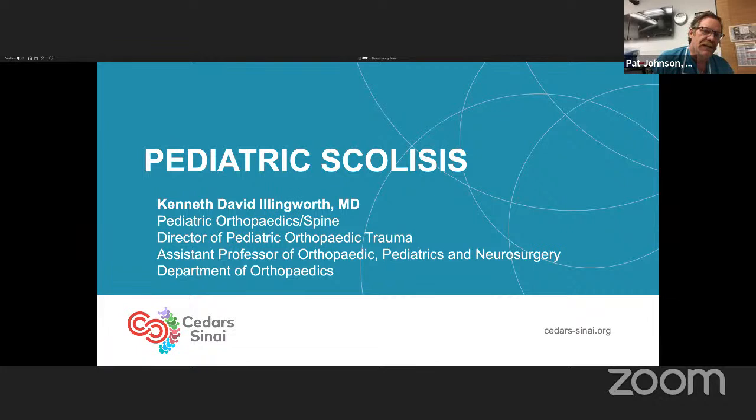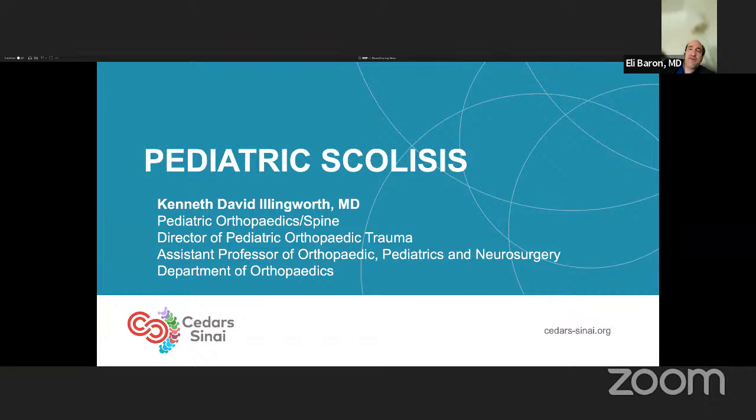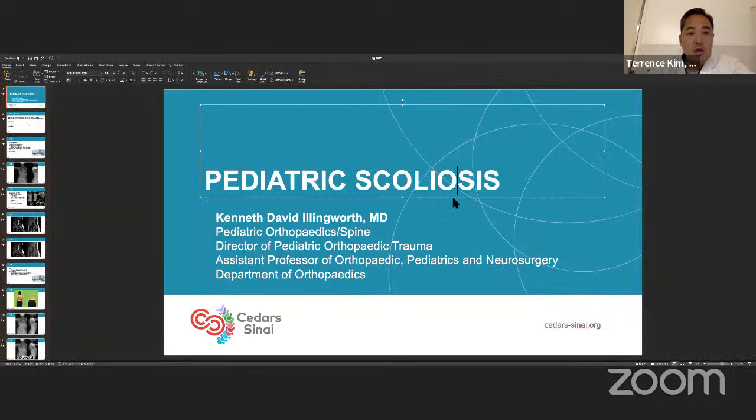Pat, I think one difference though is when I've done those kinds of cases too, they're usually cases like, for example, if I have screws, I take down a facet, I can angle all sorts of things. Here, I want it to be minimally destructive with my laminectomy and not get into the facets because he had an ADR. So I was looking straight down the midline, almost like an approach for a schwannoma without going lateral at all. In fact, I kept the muscle on the facet capsule. And I'm just wondering if that boxed me in angle-wise for all our tools.